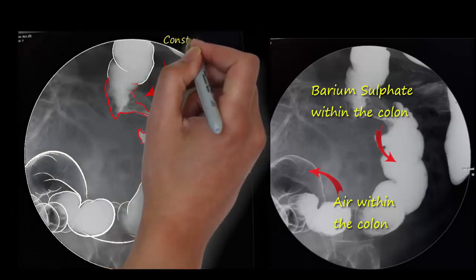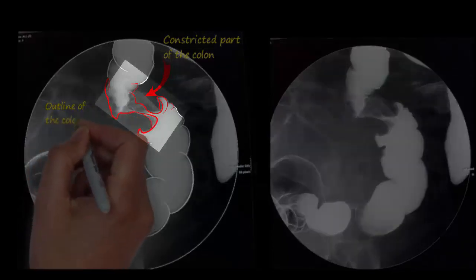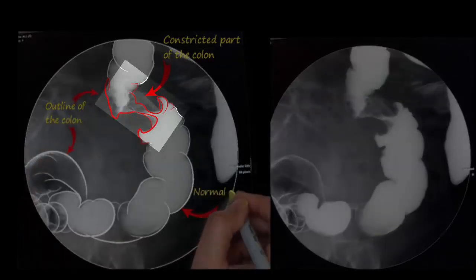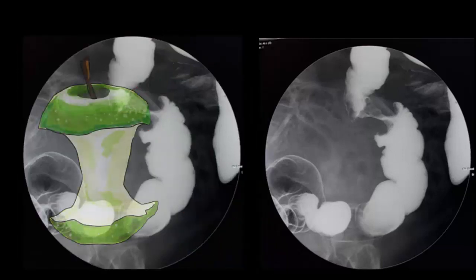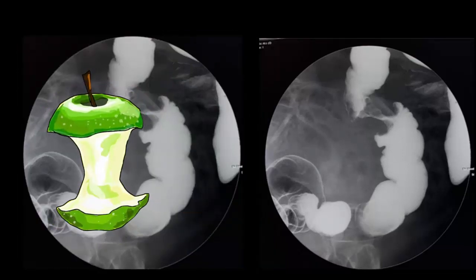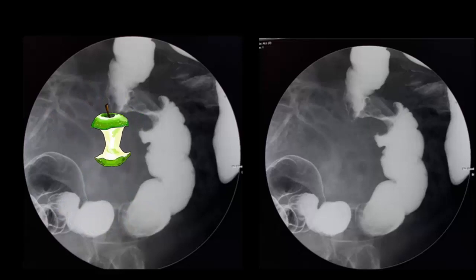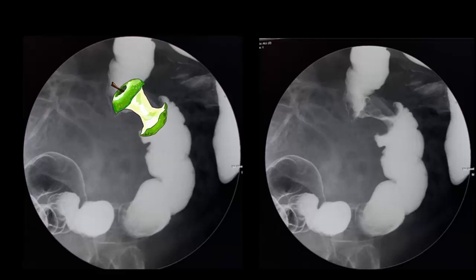These tubular structures on this image are part of the colon. You can see a short area of narrowing of the lumen as compared to the rest of the visible large bowel. This constricted area resembles a leftover core of an apple after the bulk of it has been eaten, hence named apple core lesion. It is produced by eccentric thickening of the internal walls of the colon which causes stenosis. Severe narrowing of the lumen leads to bowel obstruction.